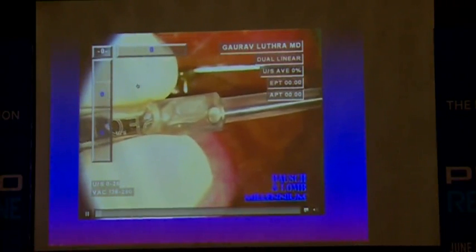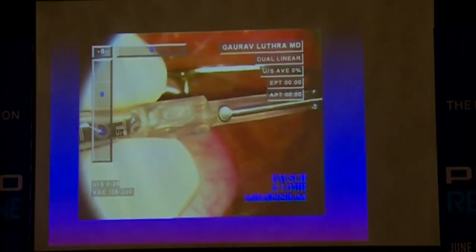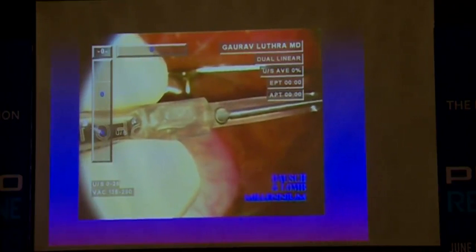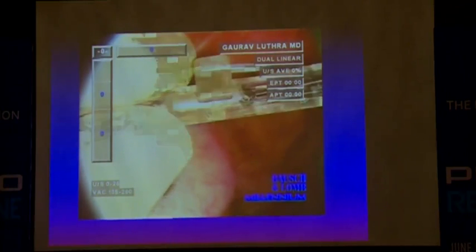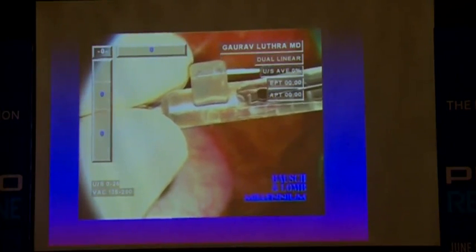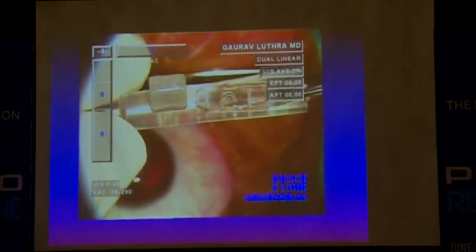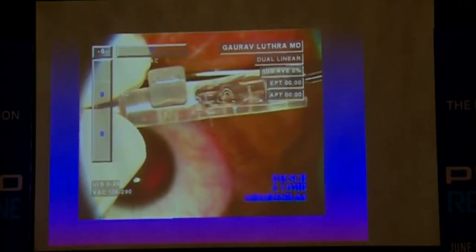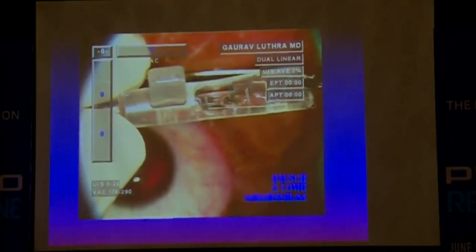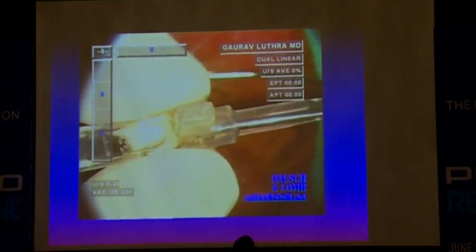And you can see how hesitantly I was loading. Why I always end up showing this is because with ICL, at least with the STAAR one, I think the loading is probably the one area which every beginner has to go through, loading the ICL. Of course, once you get through it, then it becomes much easier. So you can see that hesitation in pulling the ICL through the tunnel is not going to help. So you bring the ICL back, and that smooth motion comes within 2-3 cases. So after the first 2-3 cases, you actually realize how it has to be loaded. So that one smooth motion, as you can see here now.